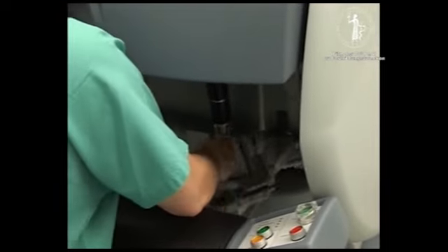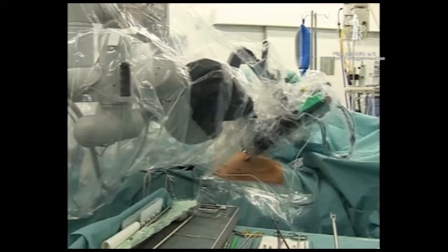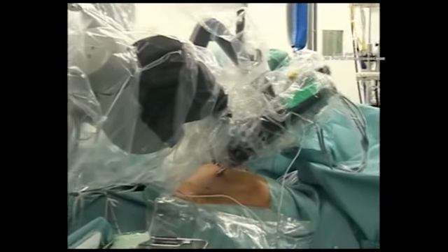Here you can clearly see the hand movements on the masters of the console and the corresponding movements made by the robotic arms at the patient.